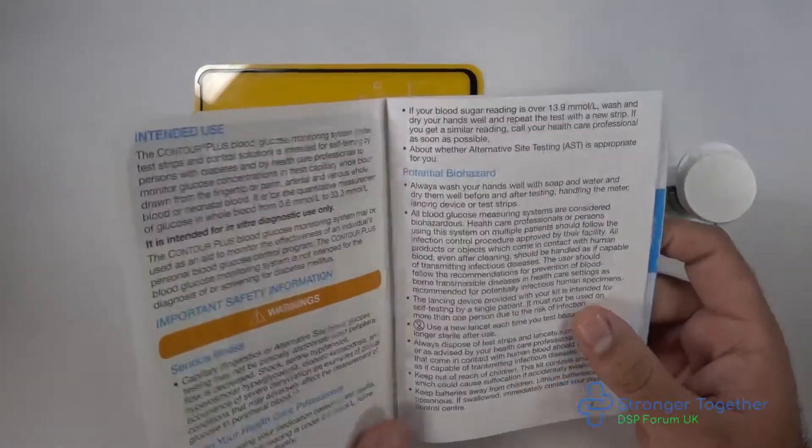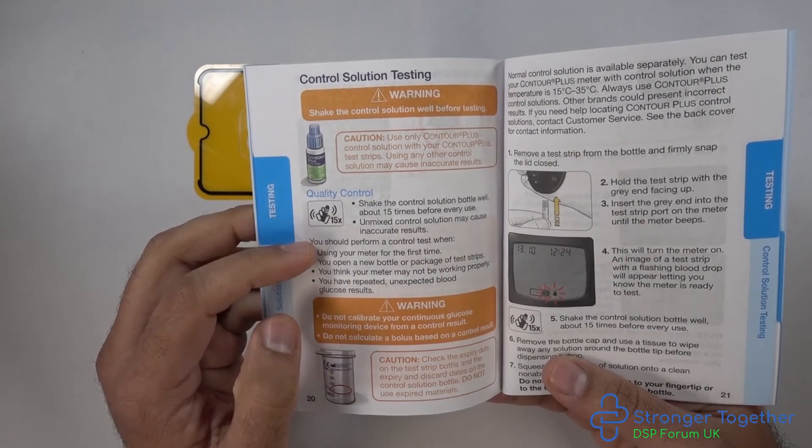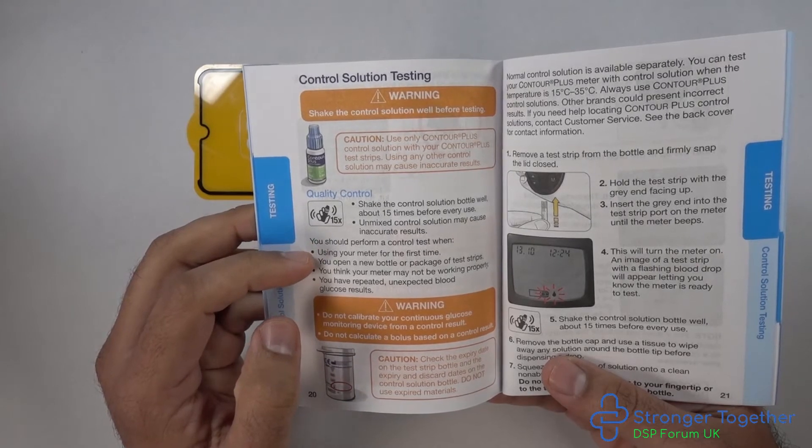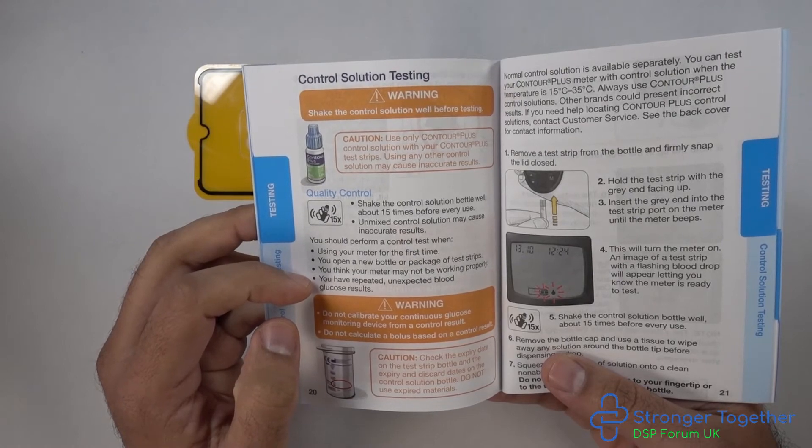If we look in the Contour Plus manual, you should conduct a control test when using your meter for the first time, when you open a new bottle or package of test strips, when you think your meter is not working properly, or when you have repeated unexpected blood test results.